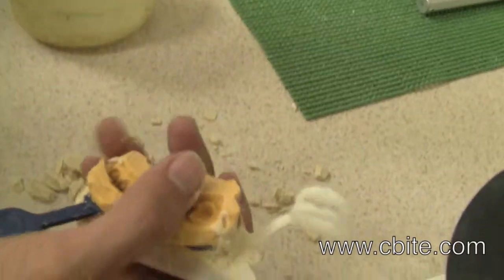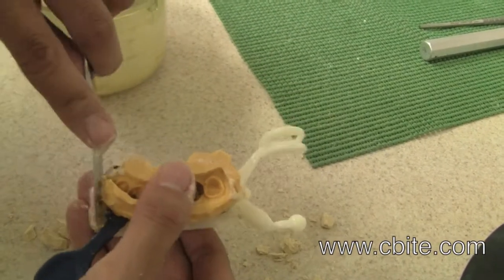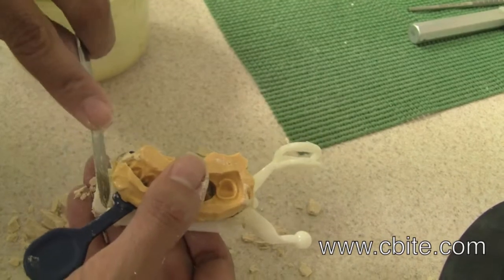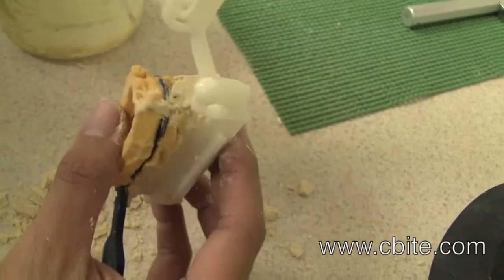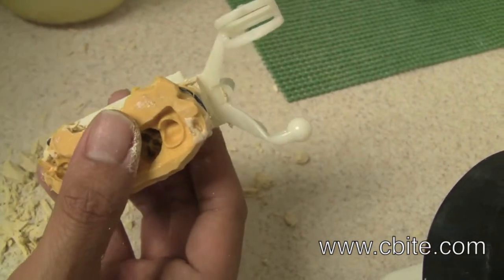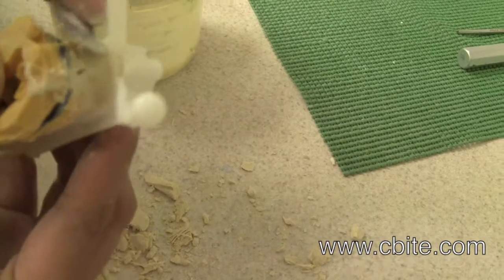If you are going to be using the incisal pin, make sure to clear away the area where the incisal pin hole is. There is a membrane on top of that hole. You will have to look from the underside to see where the incisal pin hole is — it is located up front and in the back.